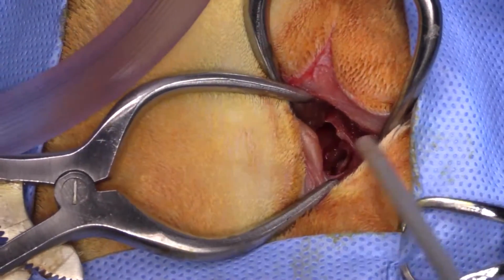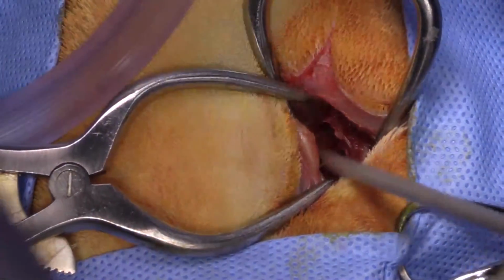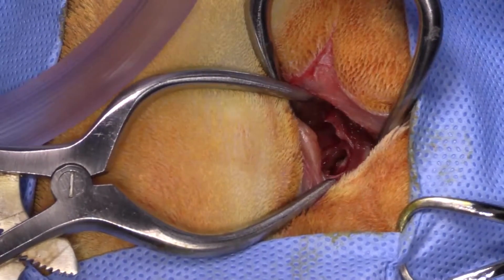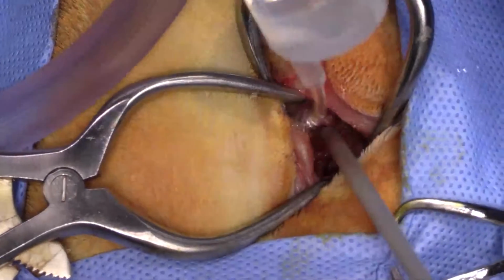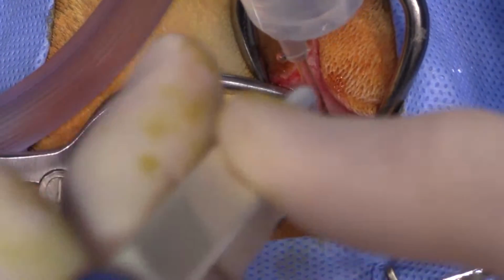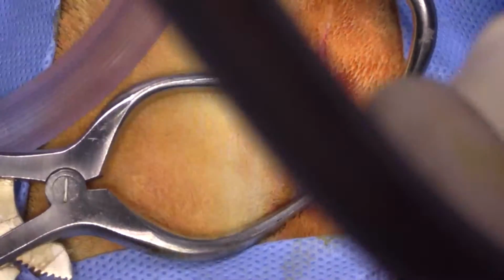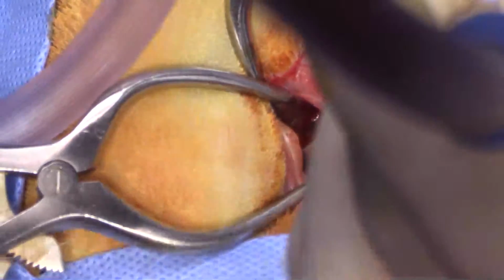So then we'll just lavage this out. So no tissue within the bulla, it's all just mucoid tissue, and that's probably because of obstruction of the eustachian tube. Can I please get some 4-0 PDS?